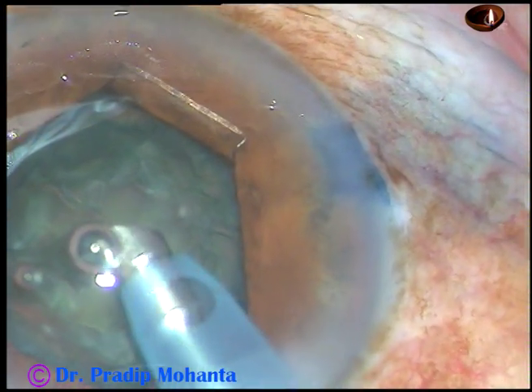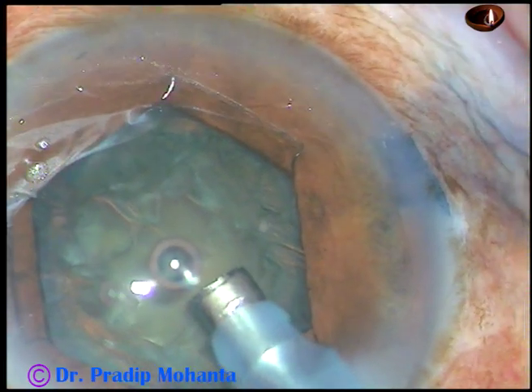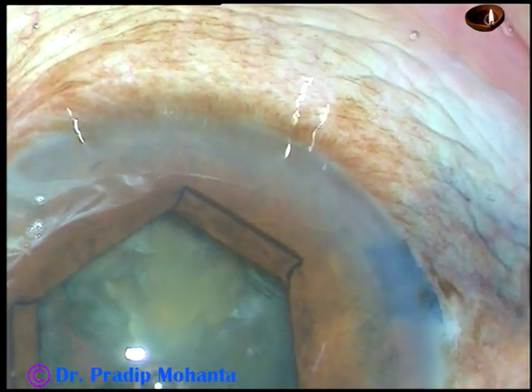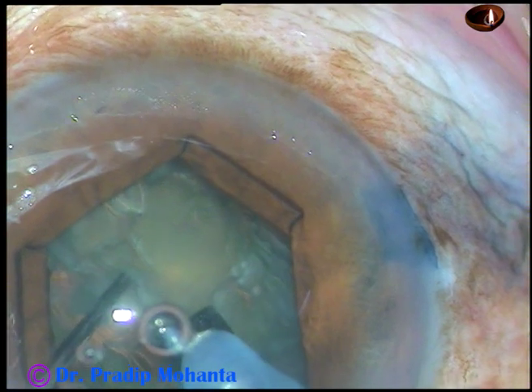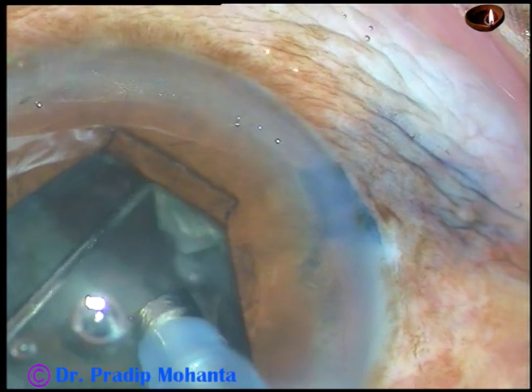After removing the superficial cortical lens matter, I bury the tip into the substance of the nucleus, and then with the help of the chopper, I divide the nucleus into two halves.